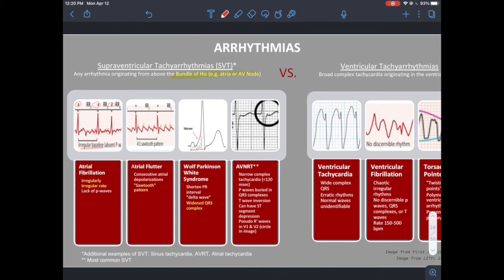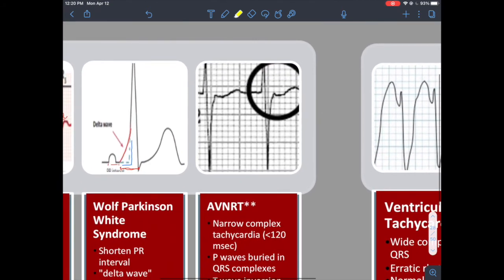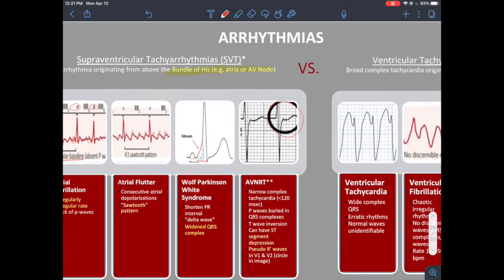AVNRT is the most common SVT — another narrow complex tachycardia. It's fast, and you lose your P waves into the QRS complexes. You can get ST segment depression and pseudo R waves, particularly in V1 and V2. There are other versions of re-entrant tachycardias as well.